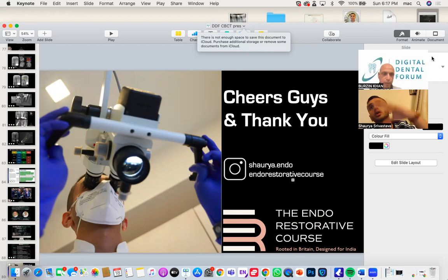You cannot just say, I want a better view of this particular area. You need to give your clinical findings as well, because a radiologist will just look at the black and white, or the gray and white, and come up with their findings. If you want an optimal report from them, you need to send your clinical findings as well.